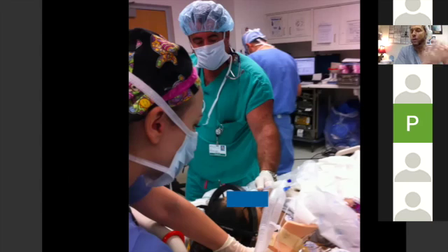And now when you do an awake technique for an unstable spine, you topicalize, you get your sedation going, which we're going to talk about. Once the tube is in, because of the remifentanil, patient's not going to be bucking and coughing. A lot of times they'll give you a thumbs up, and you say, give me a thumbs up, and they do that and say, wow, it's good topicalization, good sedation, because there's no bucking. But you really want to establish that they can move both hands and both feet before you go to sleep.